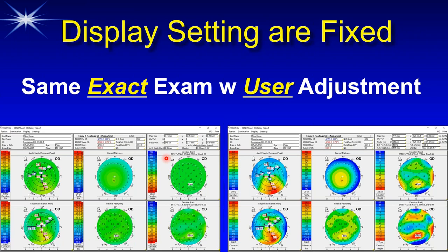When I looked at the settings, I realized the user had adjusted every single one to values that made everything look green. The exact identical exam on the right is what you should see with the settings appropriately set. The settings are fixed so that we're all talking about the same things — when you see red, it's bad, and when you see blue and green, it's good. Everything on all of the reports is set that way.